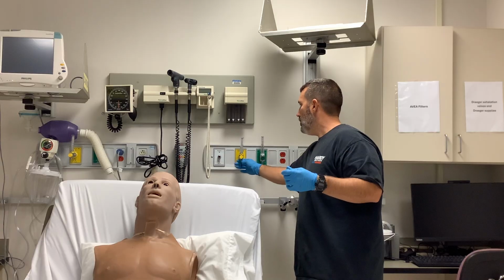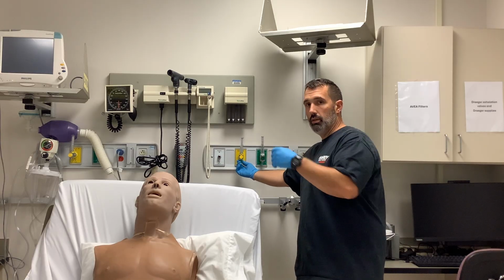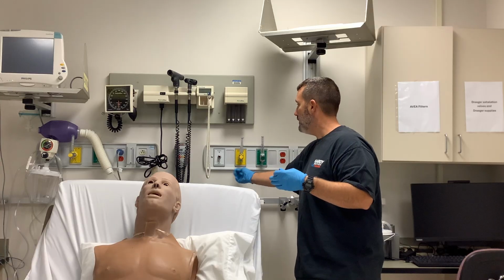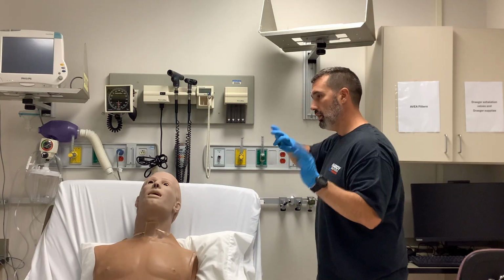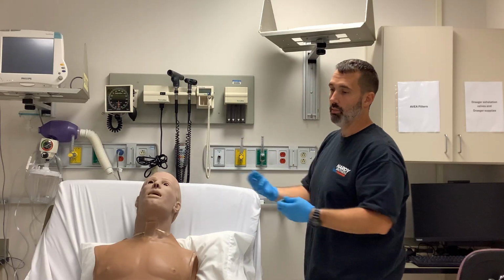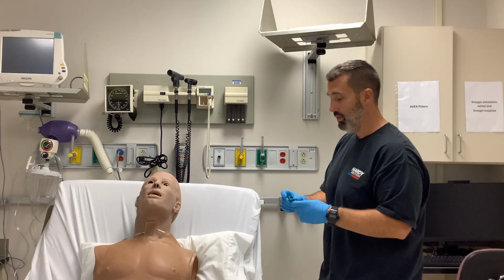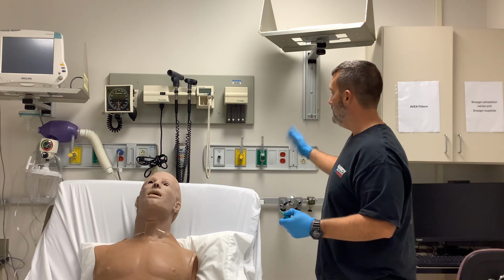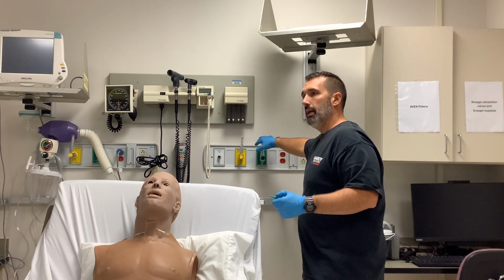So you all will be tasked with some different outlets or inlets, and I say inlet because vacuum is an inlet. If you're utilizing vacuum, it's going to suck the air in through these pipes to provide suction to the patient, if you need to suction them. And then you've got a medical air outlet and a medical oxygen outlet.